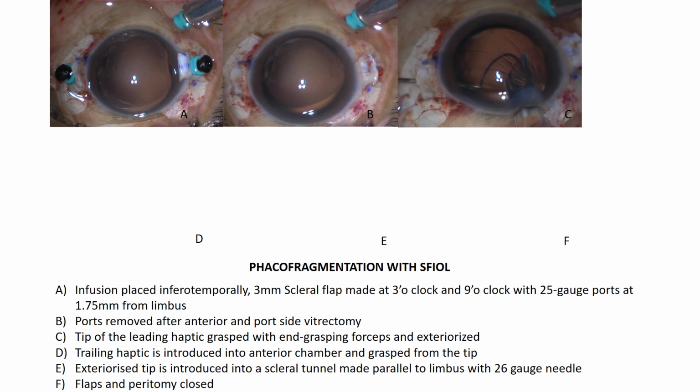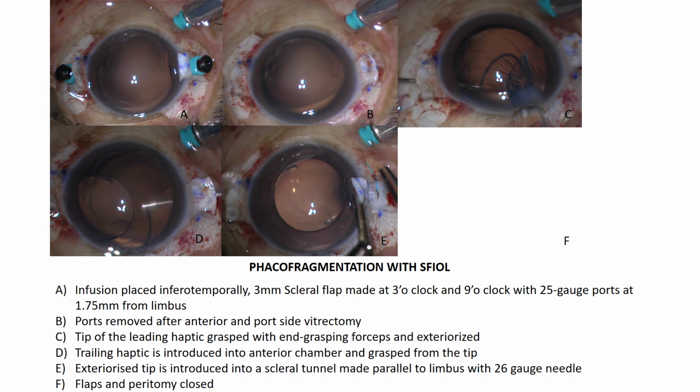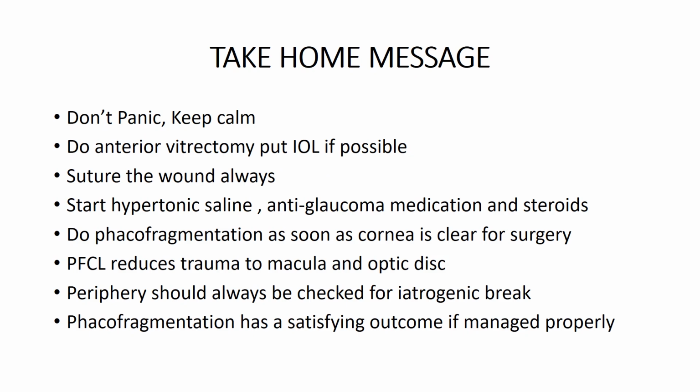After phaco-fragmentation, SFIOL can also be done by using the same ports and trying to remove the haptics from the ports itself and tucking them in.